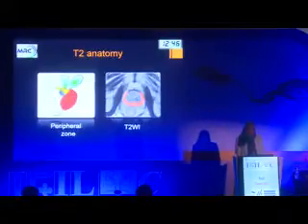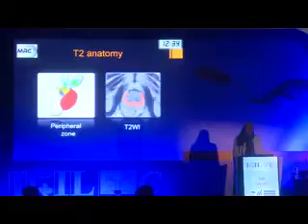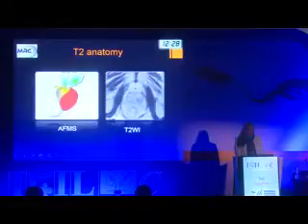The peripheral gland is a horseshoe appearance structure located at the periphery of the prostate, and it is fortunately of intensely high signal on T2 weighted image, and lucky for us because all prostatic tumors appear as a low signal on T2. The anterior fibromuscular stroma is a small structure located here as seen on the imaging.